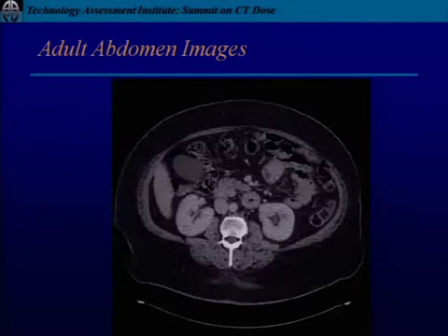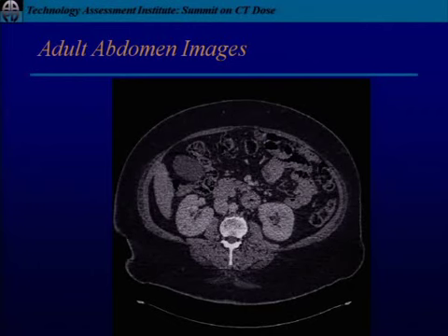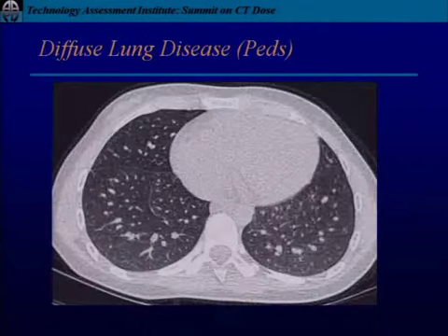Here's another level. Here I am looking at the kidney, looking at that slightly hypodense region there. And this is the 5, the 3. And again, like Jim pointed out, it has sharper boundaries. Here we go from the 5 again, back to the 3. Notice the sharpness. And to the 1. So we've also hit that noise increase just by reducing the thickness of the image.